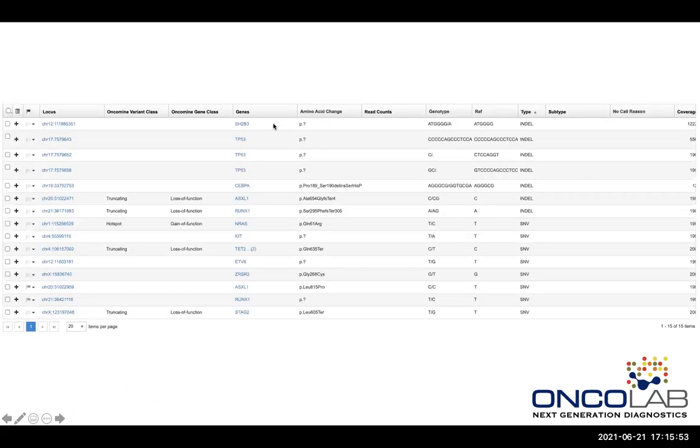variants through all the databases and check, and we will make a call individually, and then we have a combined meeting to discuss, like a molecular board meeting once a week, to discuss and see whether we agree before we issue the results. And then obviously we have this concept of a VUS, a variant of uncertain significance, which hopefully as we go along will become less and less frequent an occurrence. That's where none of the databases have reported the variant, or where they truly don't know whether this is significant or not.